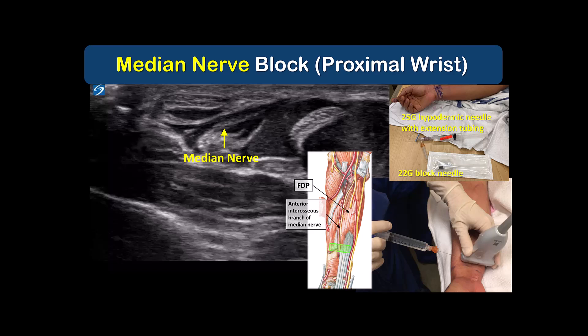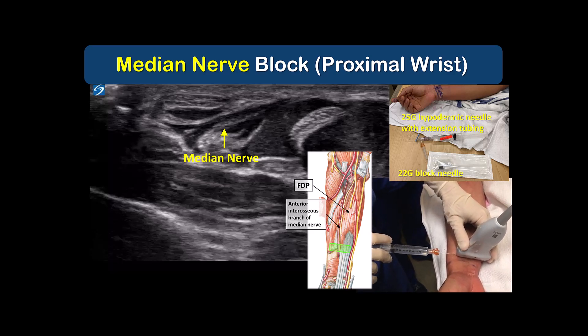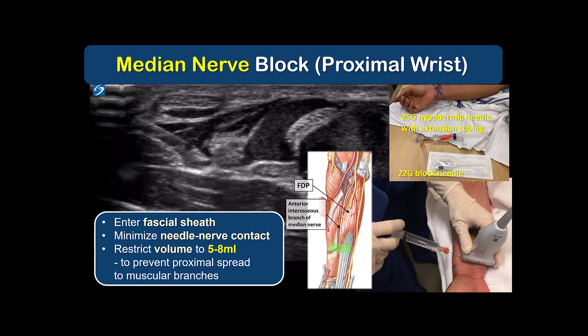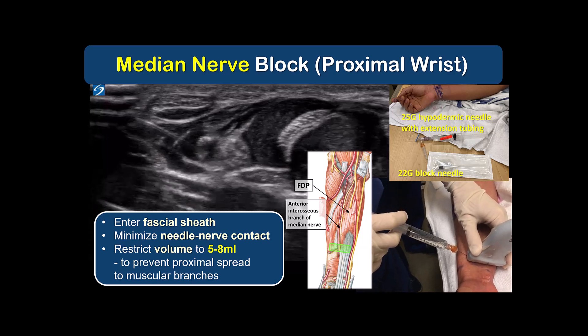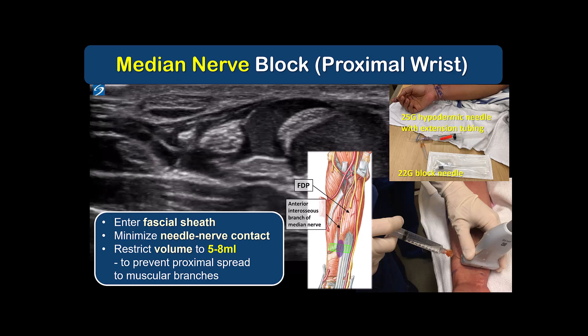The in-plane approach is probably easiest for most people using a 22-gauge blunt-tipped block needle. More experienced practitioners can use a 25-gauge hypodermic needle, either mounted on extension tubing with an assistant to inject, or using a single-operator technique, which is what you see demonstrated here. In all cases, we're aiming to enter and inject into the fascial sheath that surrounds the nerve, ideally with minimal to no contact with the nerve itself. 5 to 8 mLs of local anesthetic within the sheath is sufficient. I do not recommend more than that, as otherwise there is a risk of proximal spread along the nerve sheath to the muscular branches that innervate the flexor muscles.